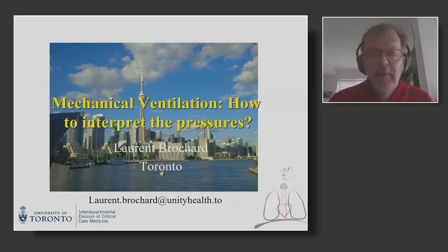Basically, the ventilator is pushing air into the chest and into the lungs of the patient, and this generates pressure. And what I'm going to discuss today is how do we interpret this pressure and what do we do with it? Because as you will see, these pressures are fundamental ways to monitor the patient and also to adjust the ventilation.